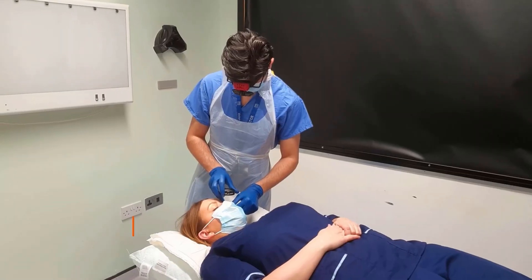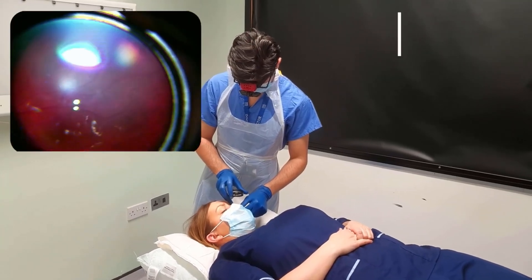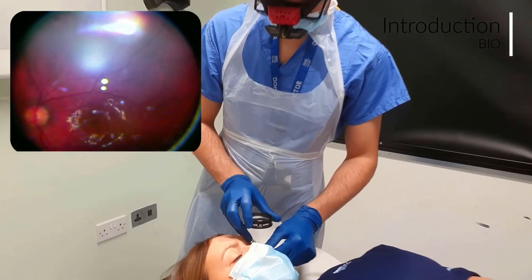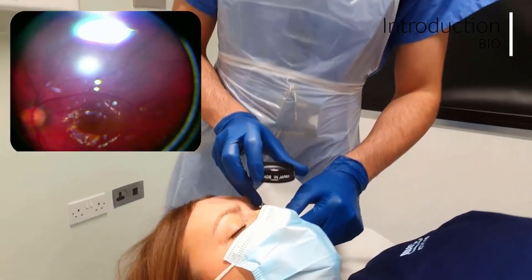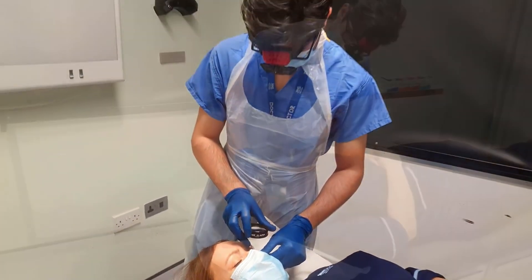Hello, I'm Sarjan Patel. In this video we will be showing you how to use a binocular indirect ophthalmoscope or BIO. The main use of a BIO is to perform a fundus examination. It allows the user to see a wide stereoscopic field of view, or 3D view, of the back of the eye.